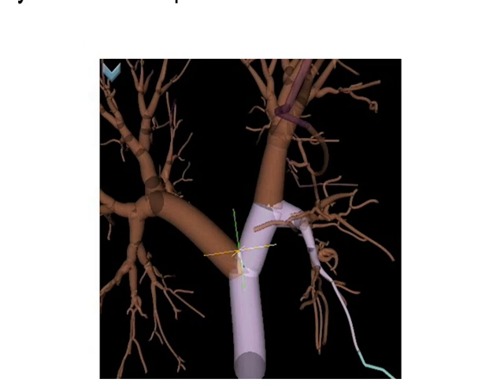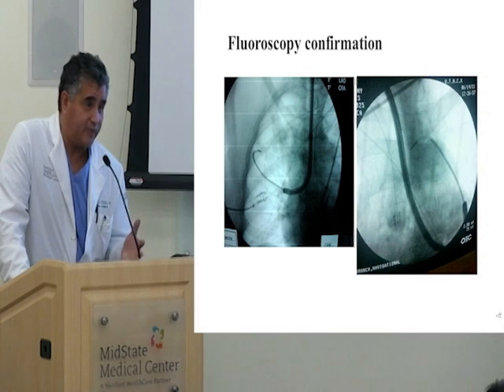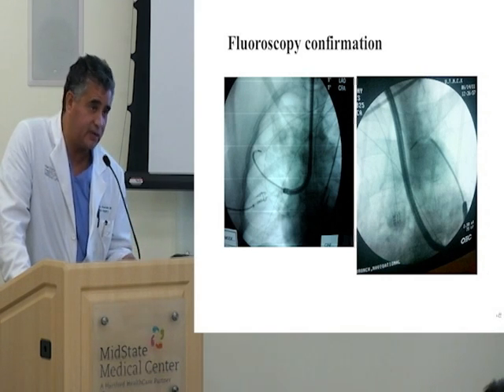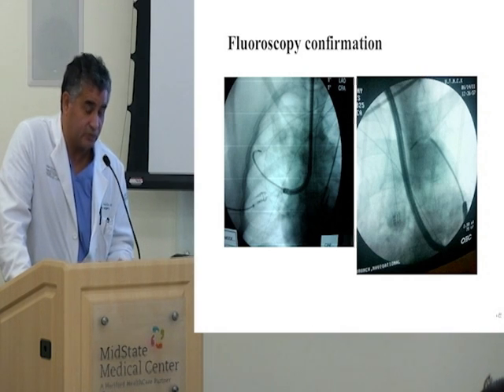So, I mean, it's a very, very powerful technology. And as I said, there are a number of things that you can do with it. One is certainly you can use biopsy forceps to get out. Sometimes, as with any other technique, you're limited by the amount of tissue that you're going to get. You can't get huge hunks of tissue. But most of the times, you can get a good amount of tissue to at least make a diagnosis.